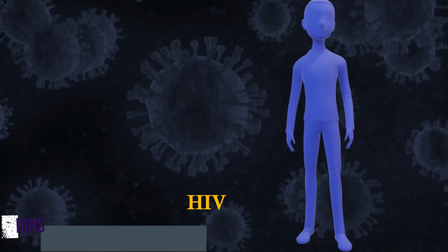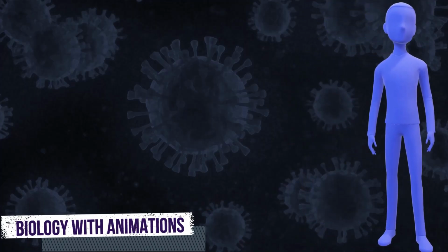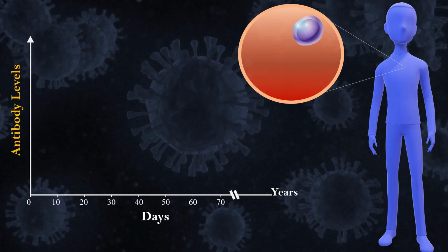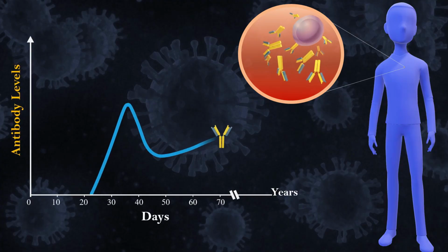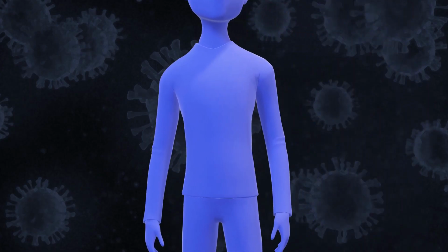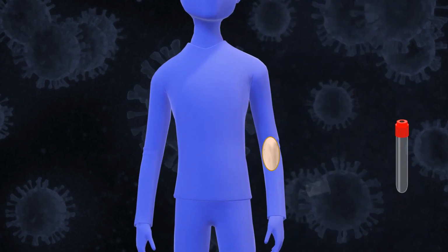When a person is infected with the HIV virus, the immune system creates proteins called antibodies as part of the body's natural response to fight the infection and to neutralize the pathogen. Usually, after an incubation period, the body begins making antibodies that are detectable for months and even years. The indirect ELISA test is used to detect the presence of these antibodies.